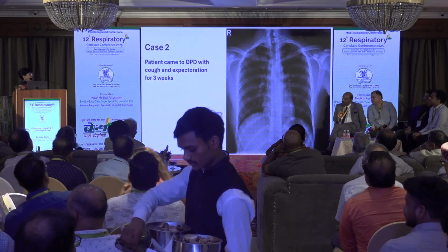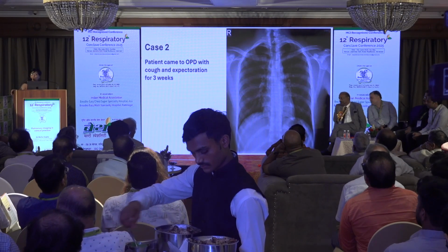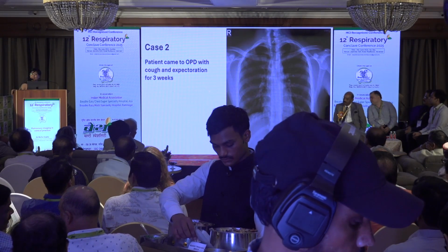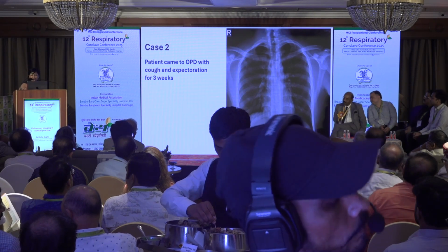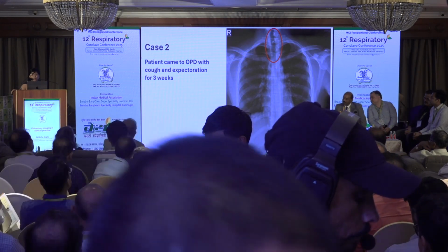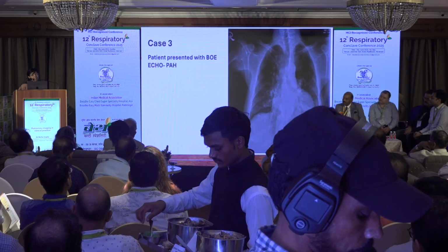Look at this patient who came to OPD with cough and expectoration for 3 weeks. Does it look normal? Everything looks normal? There is something. Without wasting time, there is a safety pin in the trachea of the patient. The patient aspirated that, right?